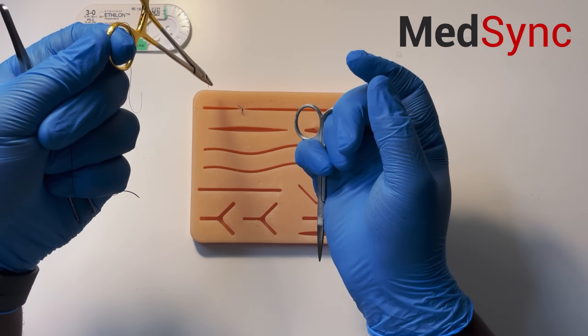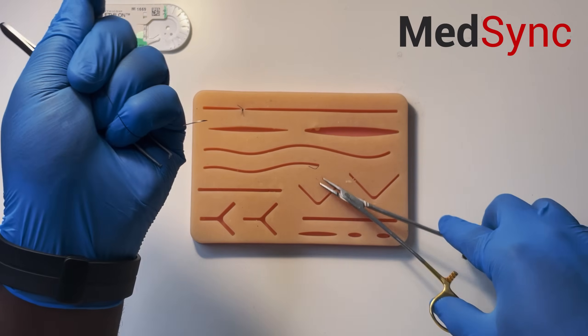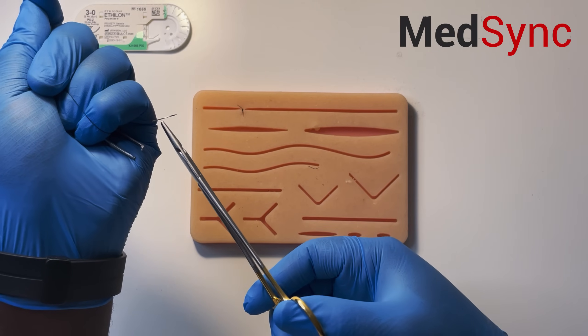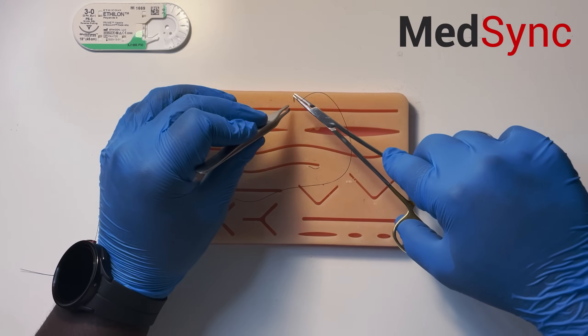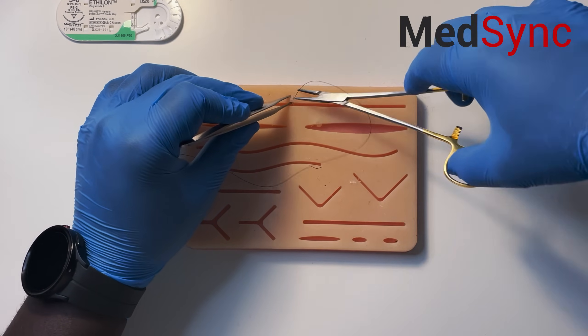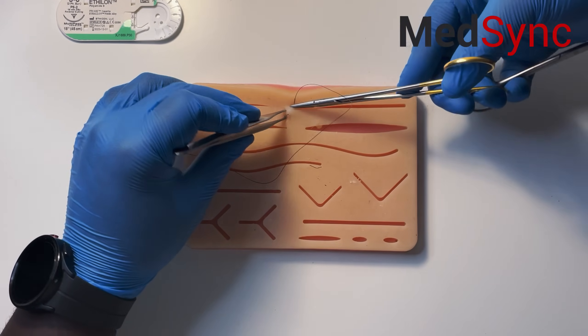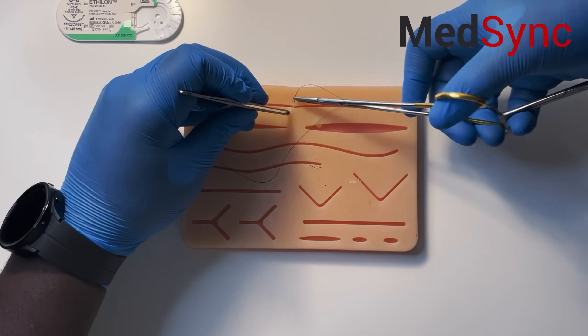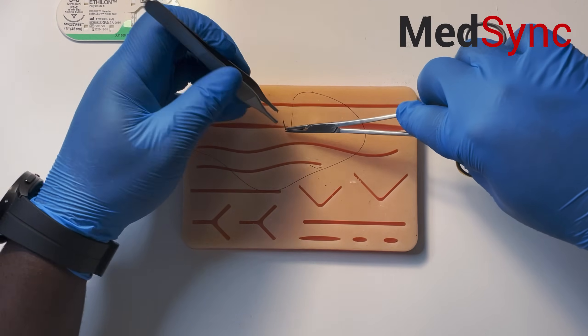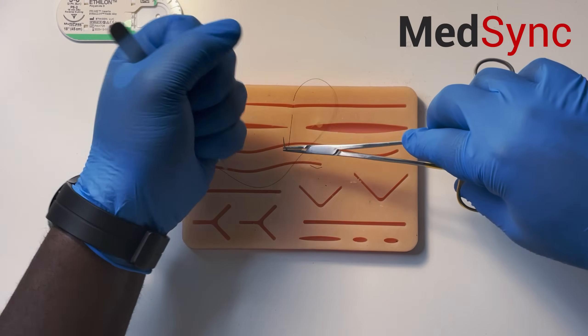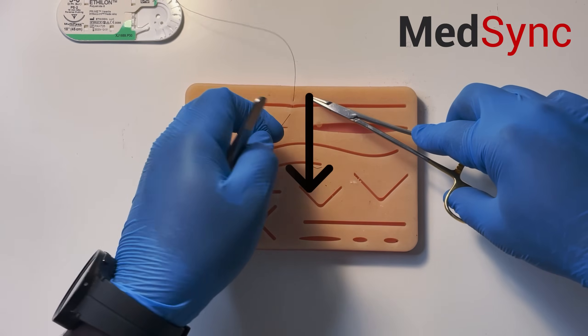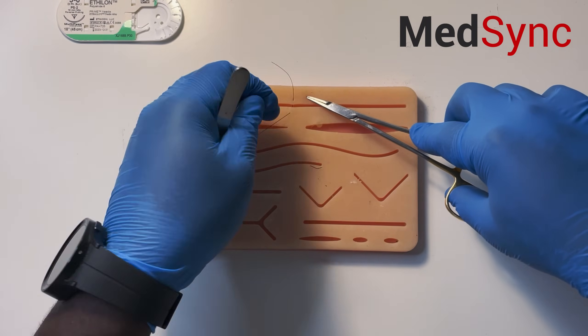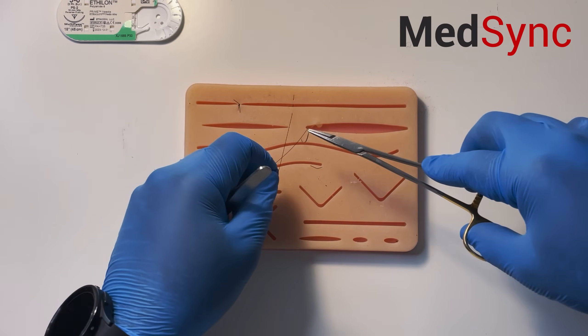Here we go again. The needle is ready and waiting for you. Enter at 90 degrees. Grab the body, mount it straight away, palm your forceps. Grab the suture in one hand and pull with just one hand. The needle is nearby.